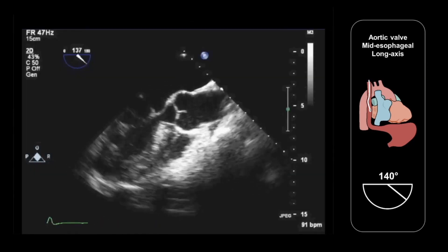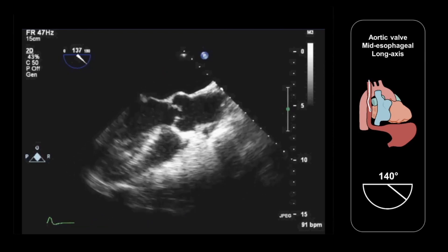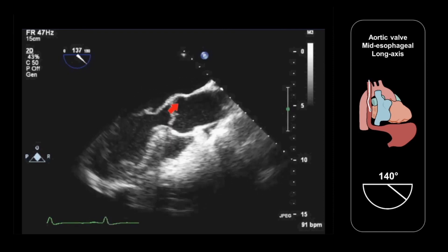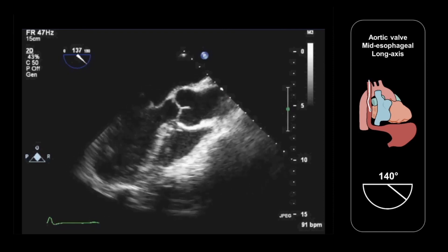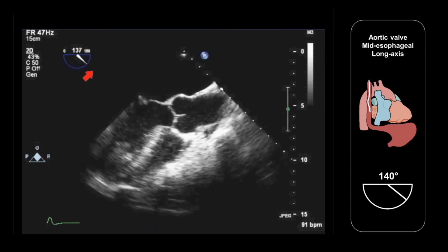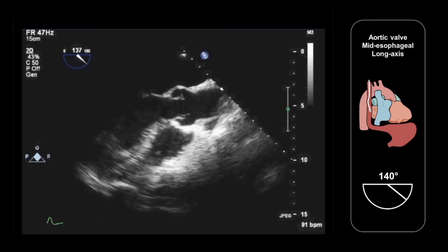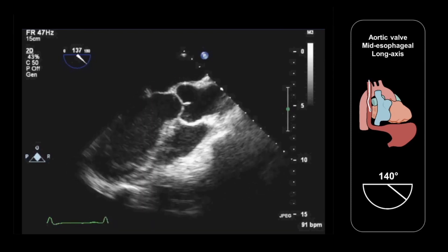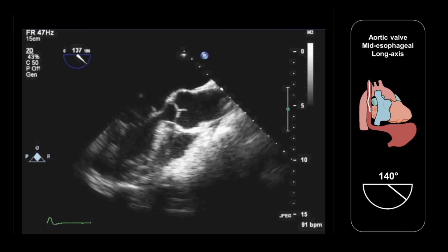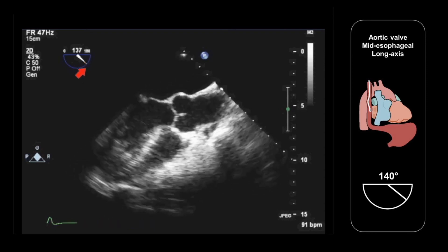Here we now have the mid-esophageal long axis view. We have the left atrium in the near field, mitral valve, left ventricle, left ventricular outflow tract, aortic valve and aortic root. We've used a transducer imaging plane angle of 137 degrees because that gave us the optimal long axis view with no foreshortening. The optimal view will normally be obtained at an imaging plane somewhere in the region of 120 to 140 degrees.